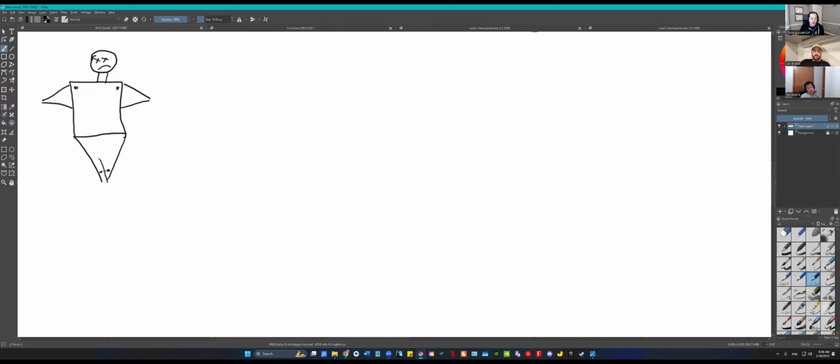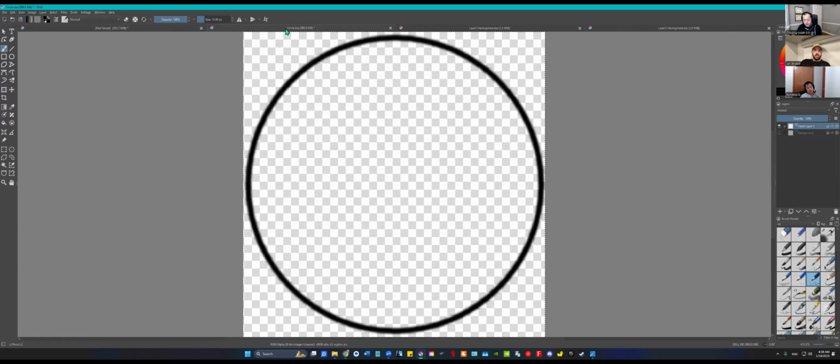I'm gonna draw the leg leads like this because the machine only cares about one of them. The other one is a ground. Okay. So the limb leads are in the shape of a triangle.